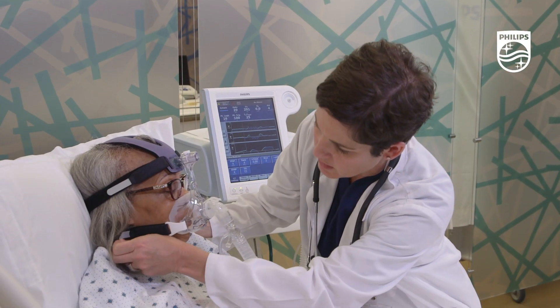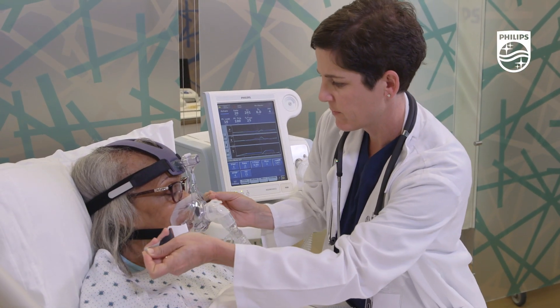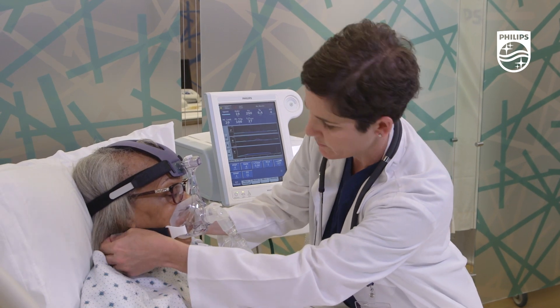Leaks around the chin area at the bottom of the mask should be addressed by adjusting the tension of the lower straps.